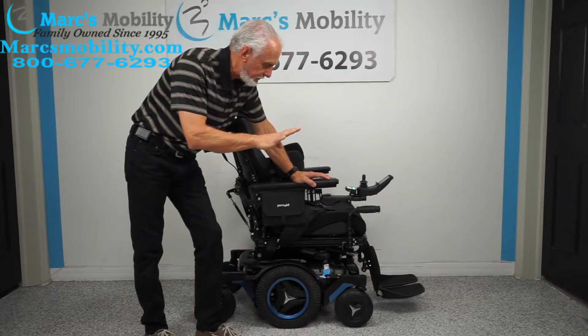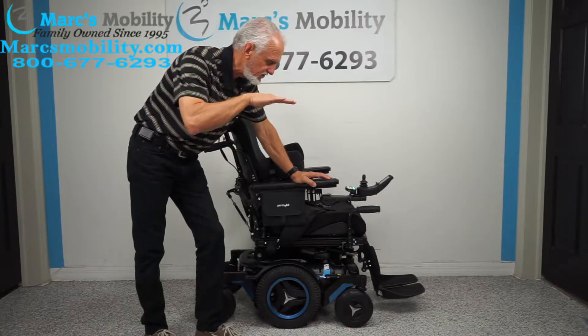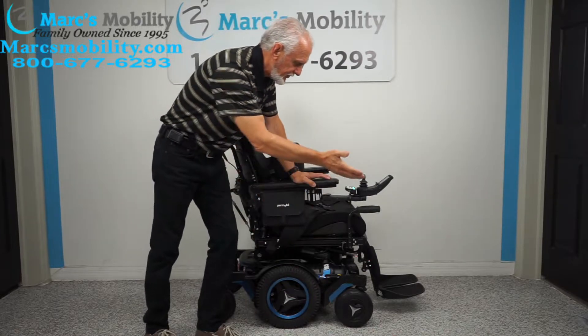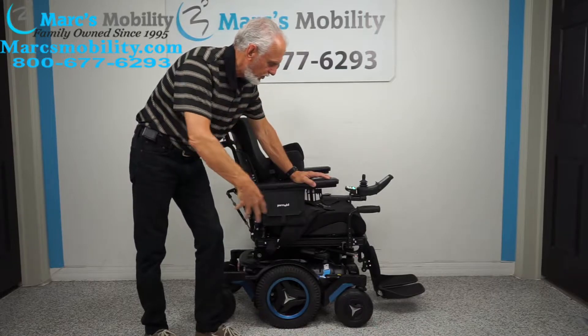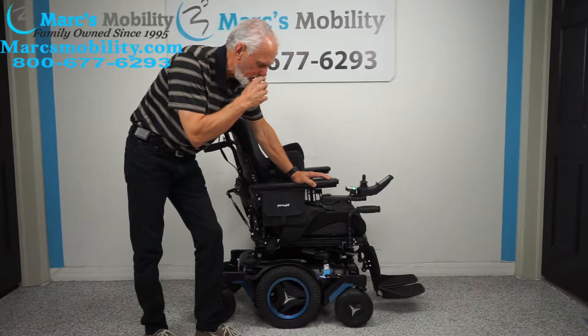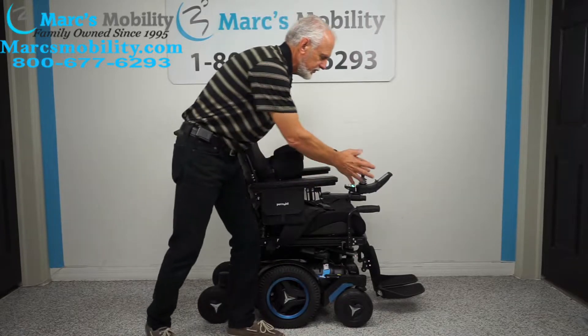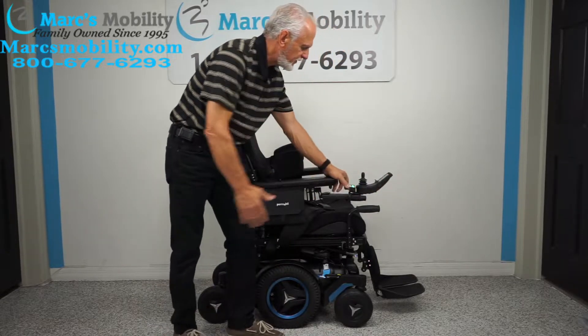This chair has four functions: it has the 14-inch seat lift, the electric tilt, the electric recline, and the electric feet. It has all kinds of other features which I'll cover as we go along. All the functions in this chair can be worked through the joystick or through the switch box right here.